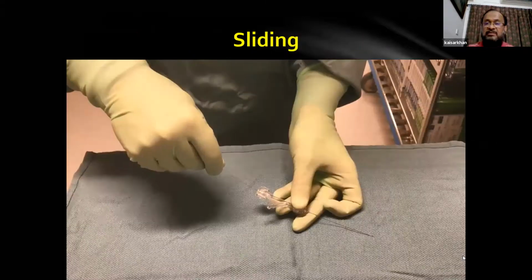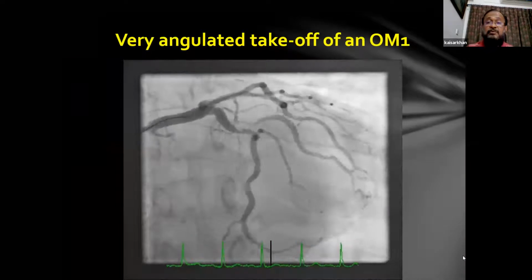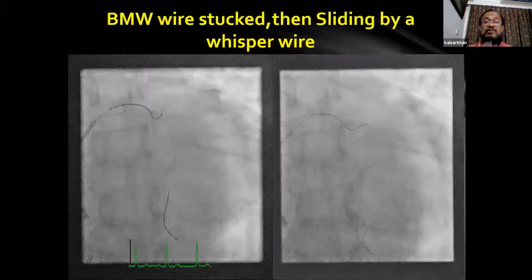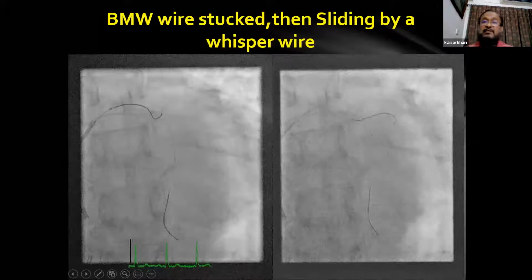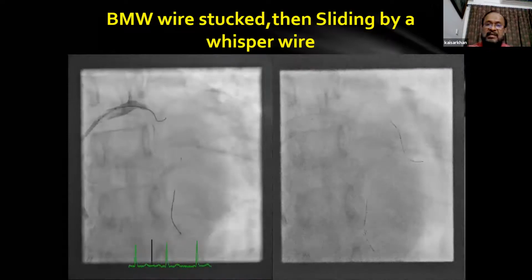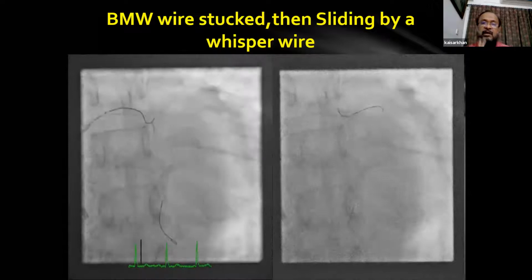Sliding method, you just slide through the micro channel. So here is the angular lesion. A small micro channel is seen in the OM origin. So tried with BMW wire, but it's stuck. When sliding, use a whisper wire, slippery wire. On the CTO, you use Fielder XTR wire. You just slide inside it, and you can see just sliding in and going down.